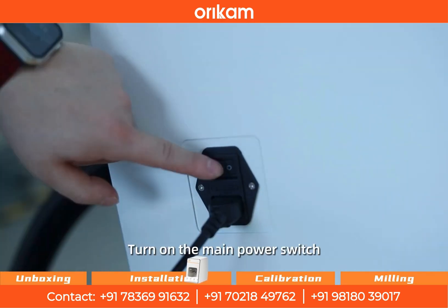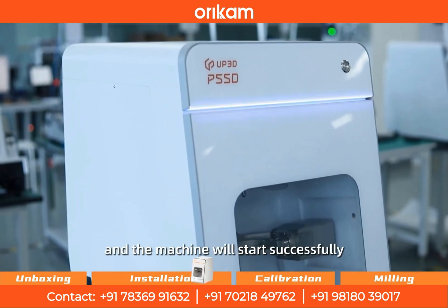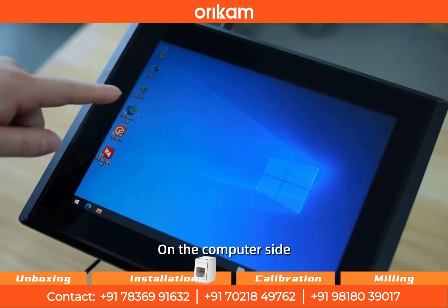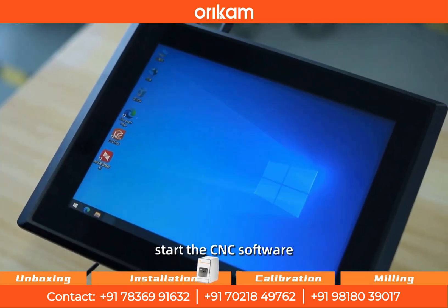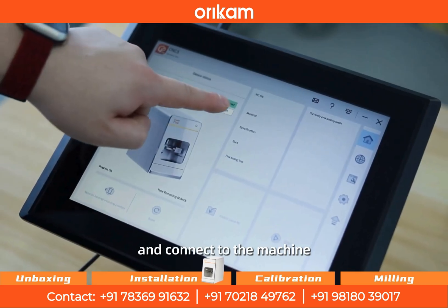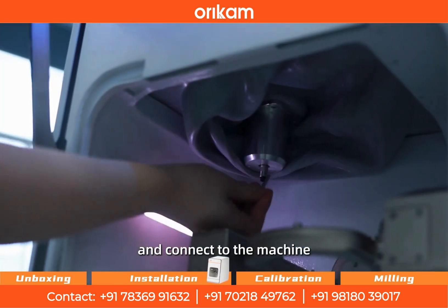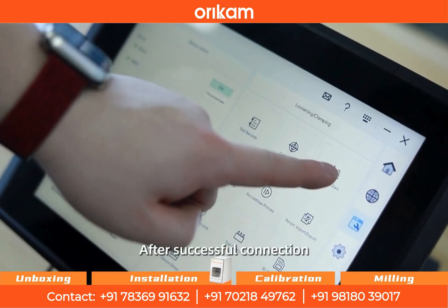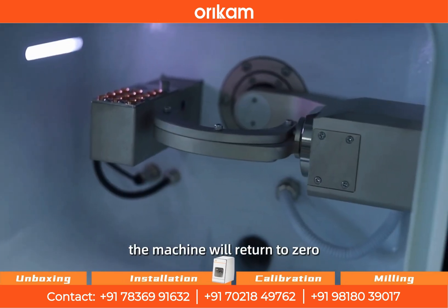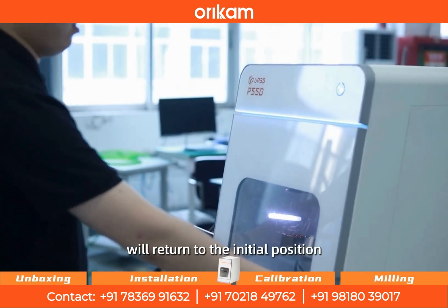Turn on the main power switch, press the start button, and the machine will start successfully. On the computer side, start the CNC software and connect to the machine. Click the release button and remove the main spindle protective rod. After successful connection, the machine will return to zero, and all axes of the machine will return to the initial position.